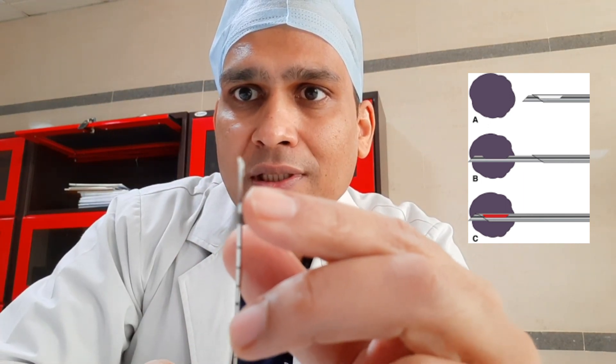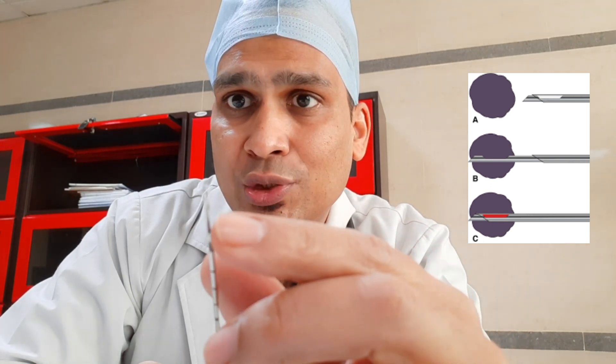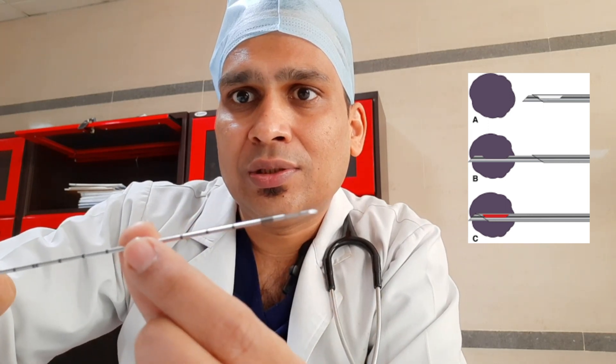The needle which was inside — around 2.2 centimeters — comes out. It appears simultaneous but there is actually a fraction of a second difference. The inner needle comes first, then the outer needle. The tissue which is pierced by the inner needle is then cut by the outer hollow needle. You can see the outer hollow needle cuts the tissue and the tissue gets stuck in the notch.